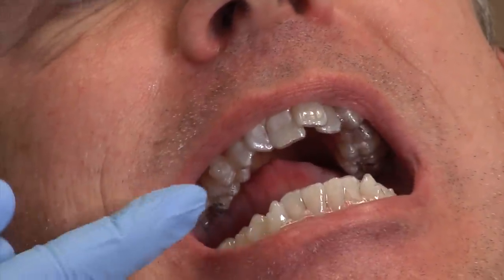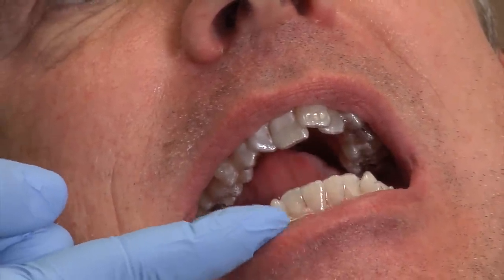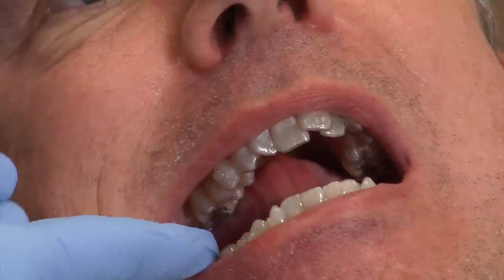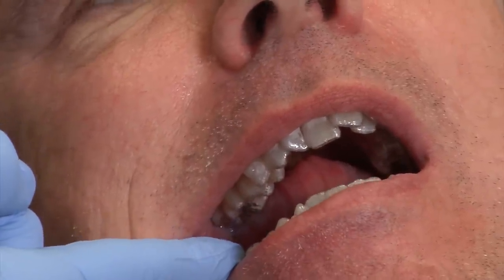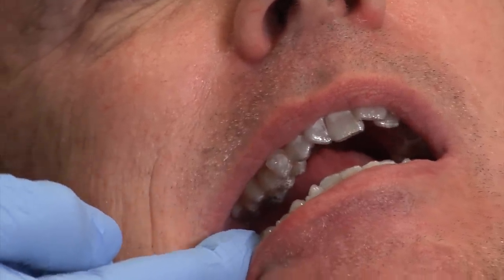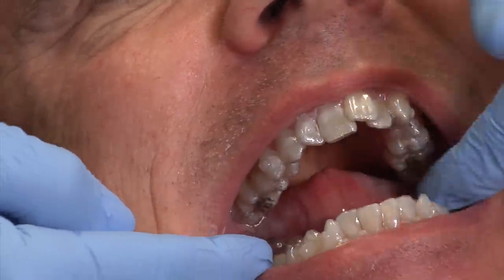To remove the aligner, you never want to take it off from the front — this will cause a hairline crack and break the aligner. You always want to go from the very back. If you have a little bit of a nail it helps; just gently lift up and work your way around.